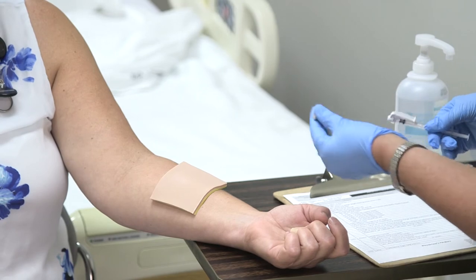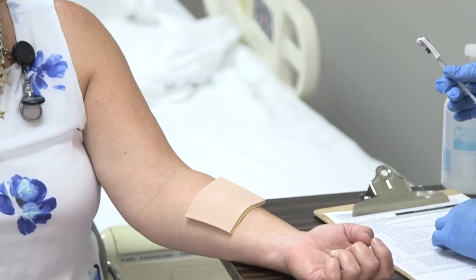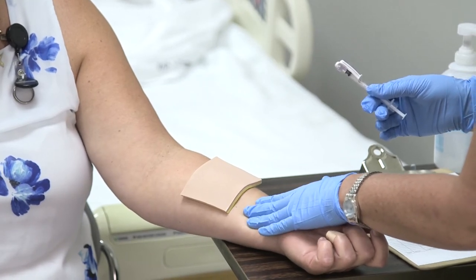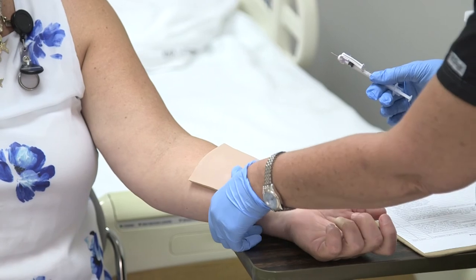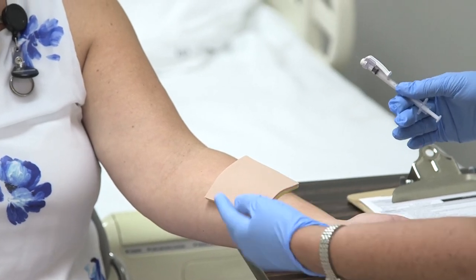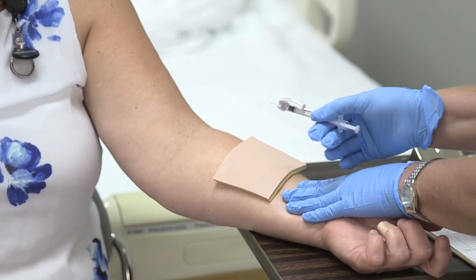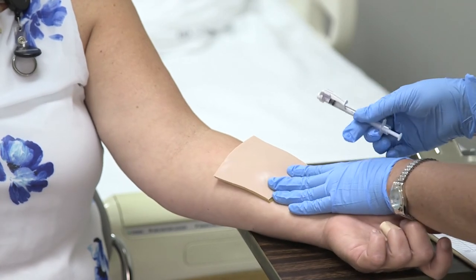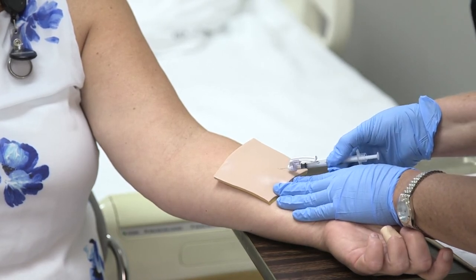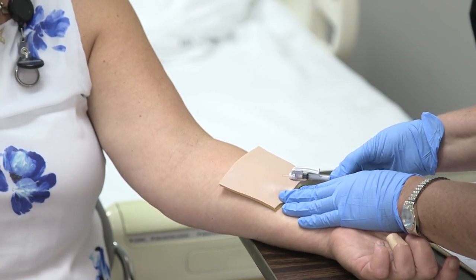When I'm ready, I'll make sure my bevel is up. You also want to pull the skin taut while giving the injection because skin tends to roll when you insert a needle. Some nurses pull the skin from above, but I prefer to pull from below so my hand isn't in front of the needle in case I slip. Make sure the bevel is up, go in at about a 15-degree angle, and only advance about an eighth of an inch.